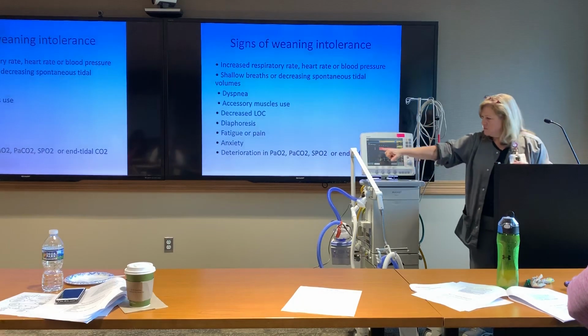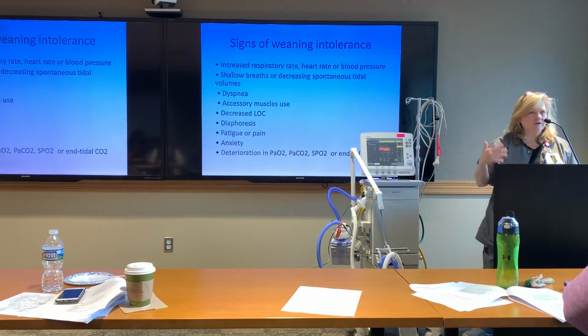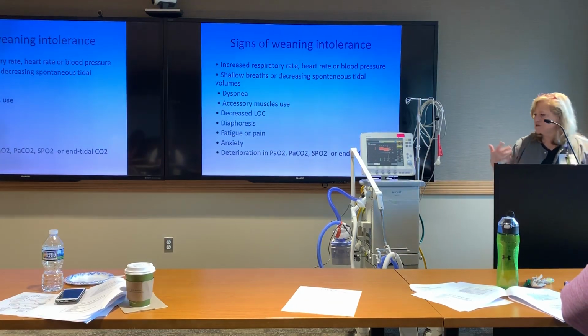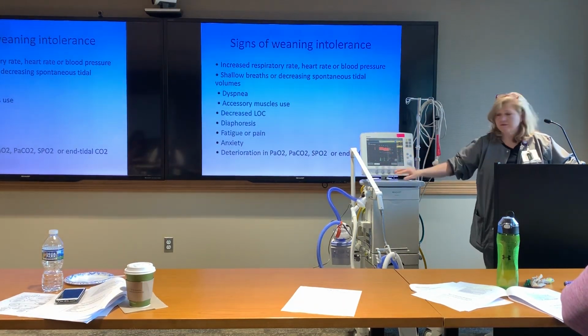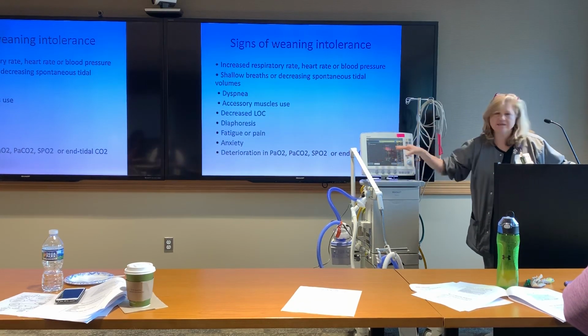During an SBT, pretty much it should be nice and even. You really shouldn't see wide fluxes in tidal volumes, some fluxes in tidal volumes, of course. So it's a nice picture, and you can look at it. This can be adjusted, 1 hour to 2 hour, 1 to 3, so you can see the whole trial.